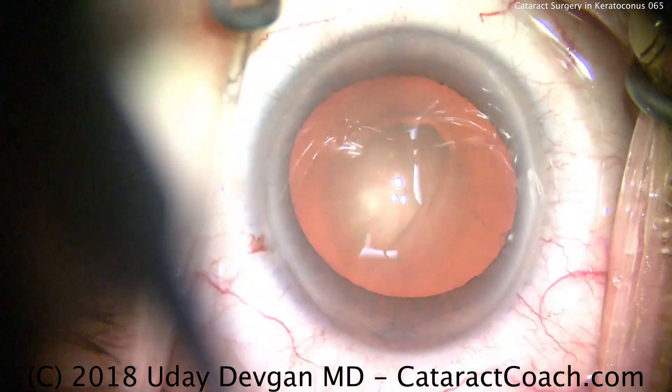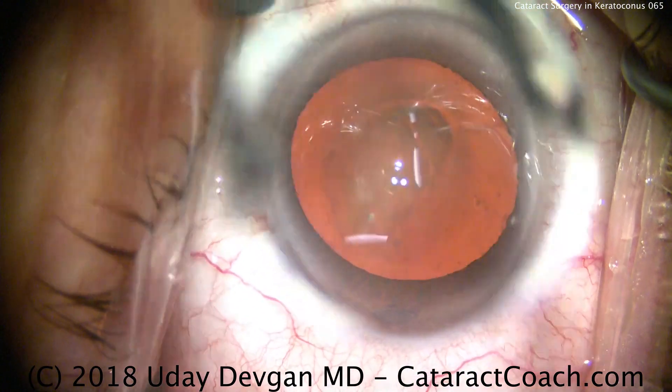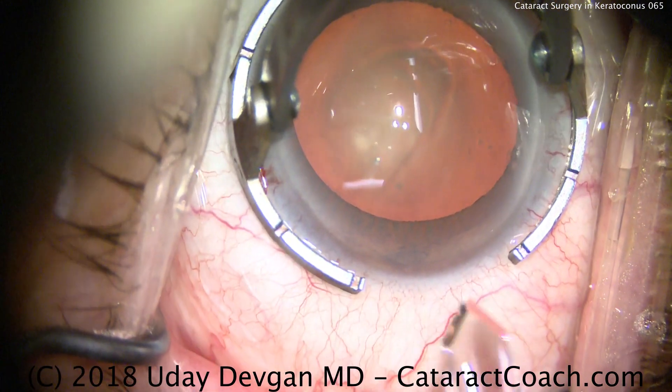This patient has corneal keratometry values in the mid-50s — 54, 55 diopters.